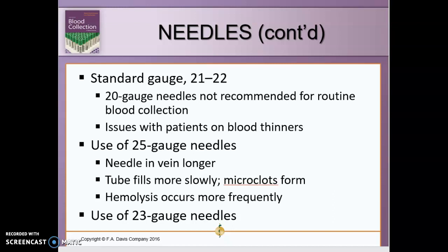However, if we're looking at different levels in the blood, such as your lipids, your cholesterol, your red blood cells, this maybe would not be appropriate because we run the risk of it damaging that blood as it pulls through to go to the evacuated tube system.